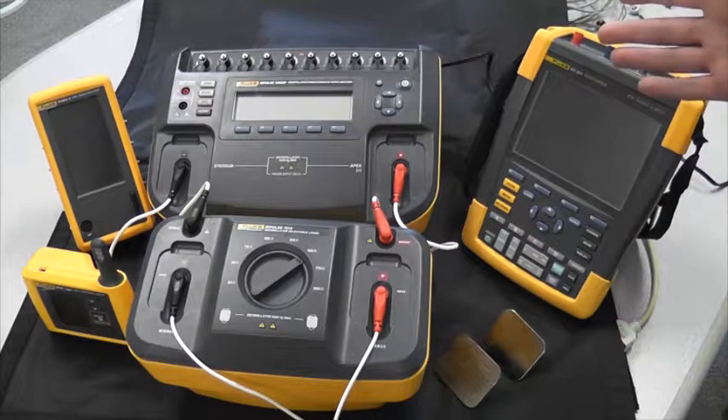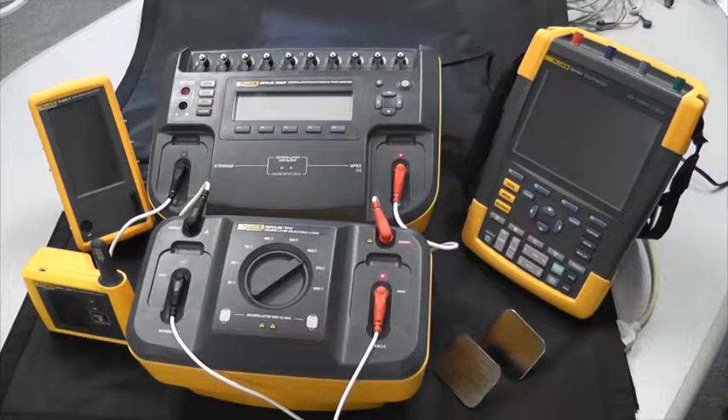This is the entire solution to performance test your defibrillator/pacer. There is of course other testing that needs to be done, such as electrical safety. To learn more about all of our products, visit FlukeBiomedical.com to learn more, request a quote, or request a demo to trial any of these products on your own.